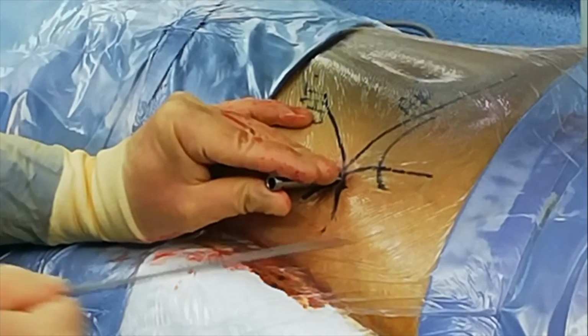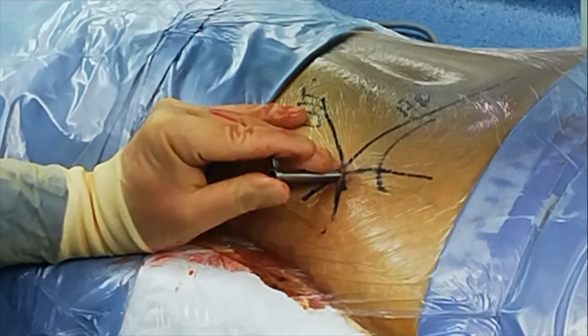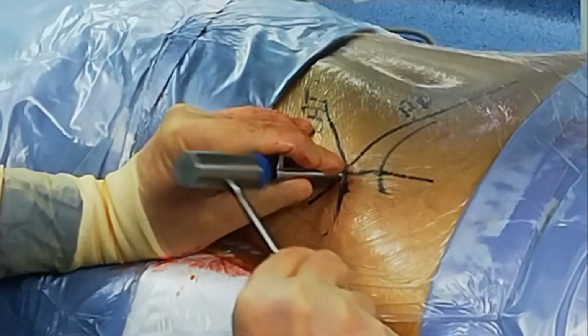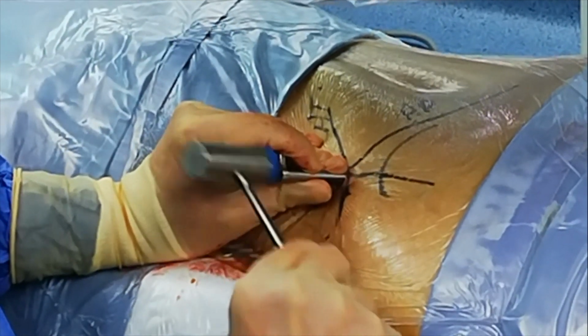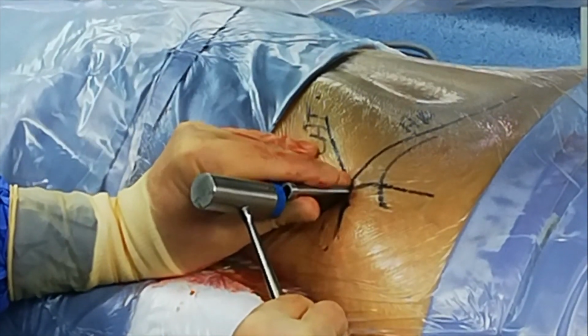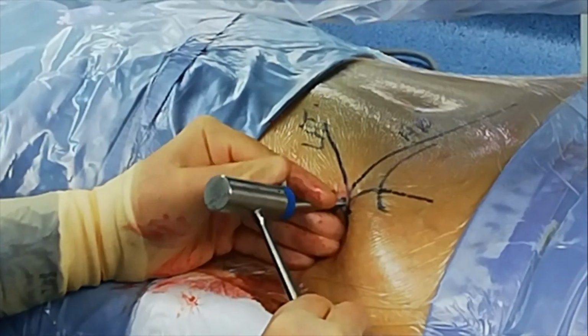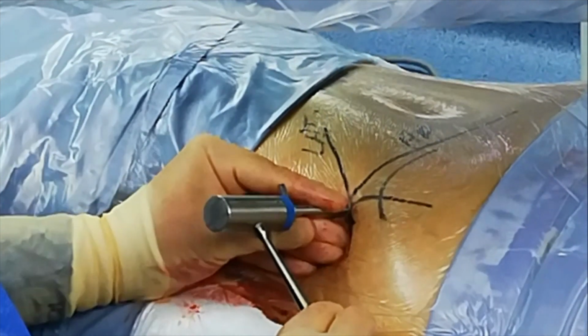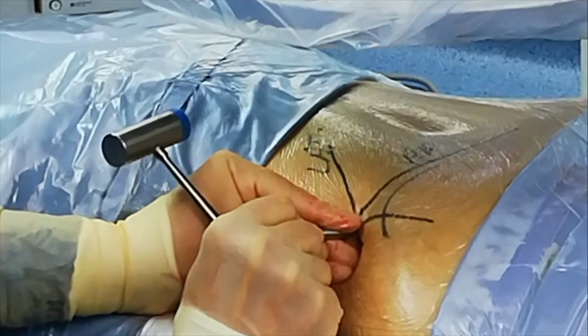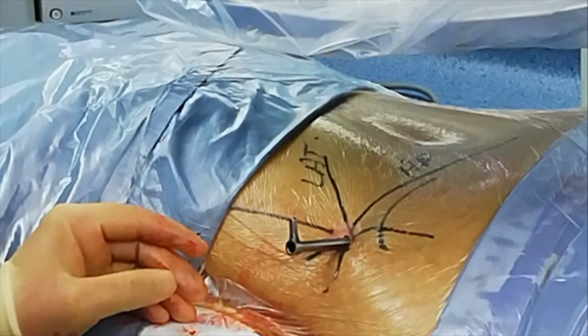So, thank you. Hammer, please. What I do to anchor the cannula in a case like this one is just to hammer it gently in the recess. It stabilizes the cannula for you. It frees up your left hand, which is holding the scope. So just gentle tapping, and now the cannula is secure, and remember, it's facing up.